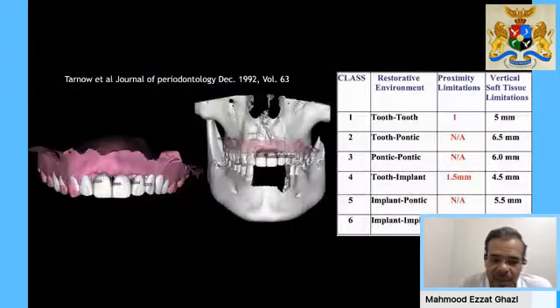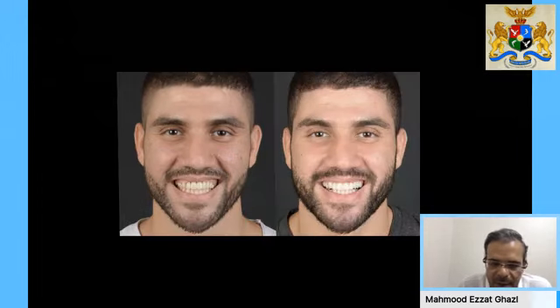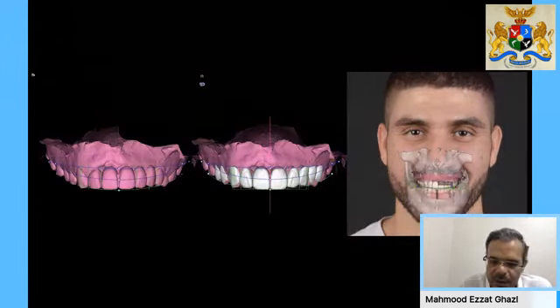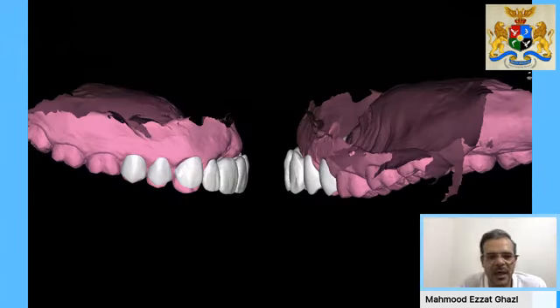And now, as you can see here also, I'm going back to the slide. From the smile design that we have done, we decided that we needed to do some gingivectomies or crown lengthening in the premolar areas. So this is part of our plan once more. The CBCT was used. We fabricated the guide. From the guide, we started to decide for our crown lengthening and the gingivectomies that are going to be done at the premolar areas. And we started to bring in our wax up.